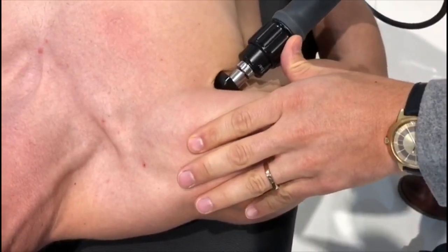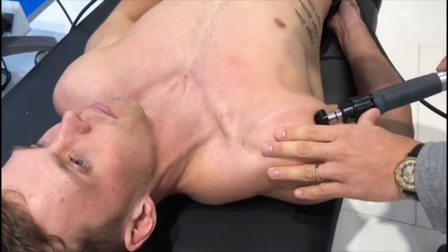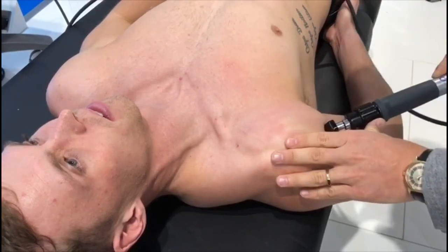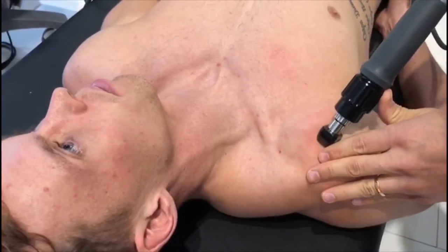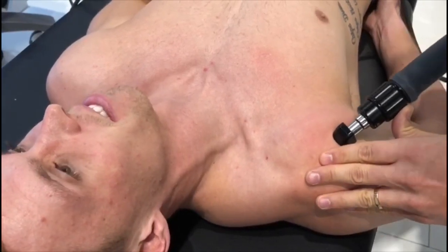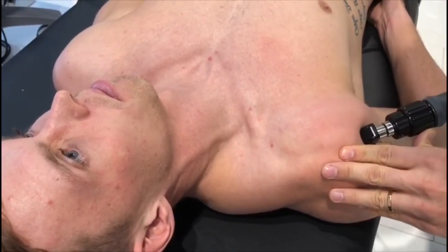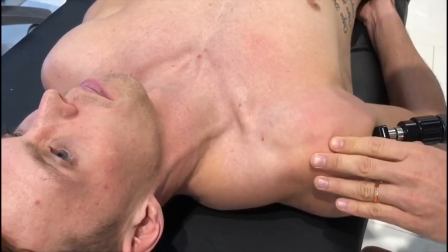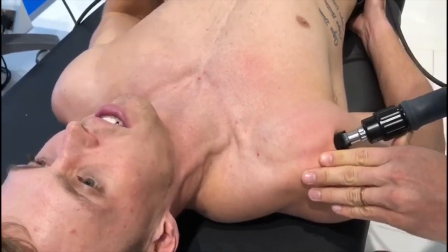So how does this feel compared to the posterior parts? Similar. That feels a good one. Because you can see on your skin here that it's a little bit tight, this region here. Right there. And this is where it's a bit stuck. You can feel the muscle firing, or trying to fire. Alright, alright.